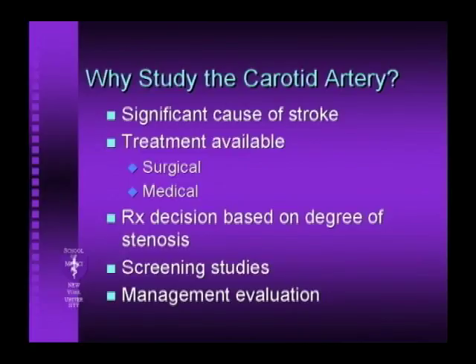And one of the questions I always get asked is, which is the right test? And there is no answer to that question. It's whatever you feel more comfortable with, whatever your referring clinicians like, whatever fits into your workflow in terms of getting the patients through. They're both quite good. So that's not really the issue. The issue is maximizing the use of both.